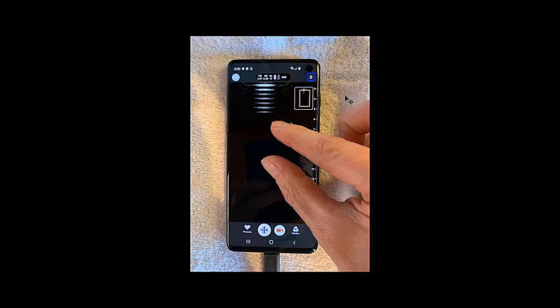If you don't want to increase or decrease the depth, but feel you need to zoom into an object, it's not one finger you would use, you would use a finger and a thumb, and you would just do the pinch and zoom thing, and you can see up here where the area on the screen you're zooming in on. We won't have to use that too often.